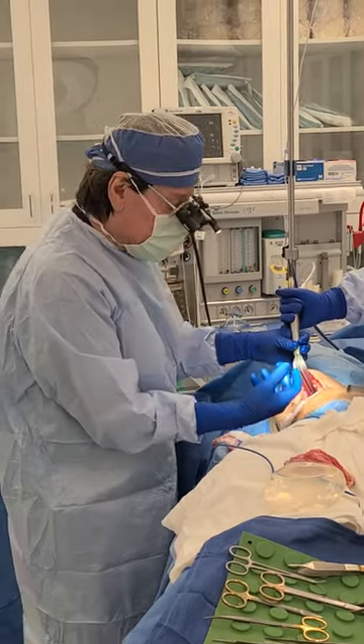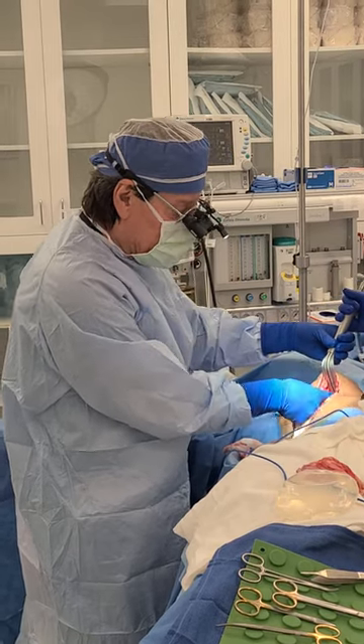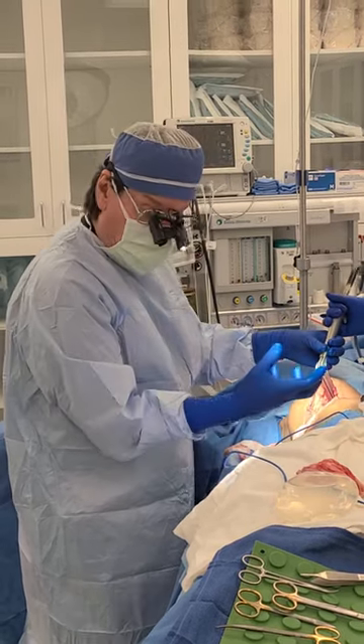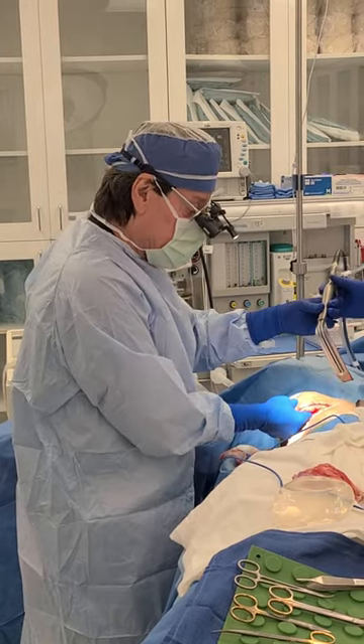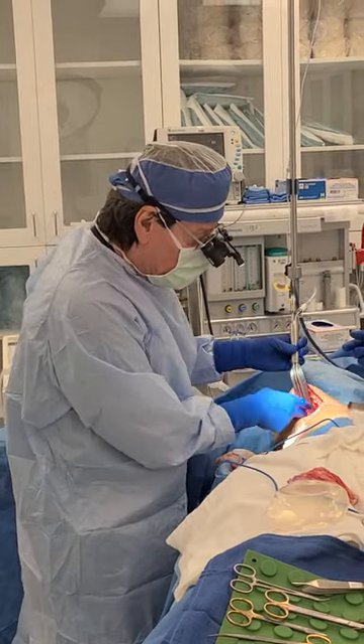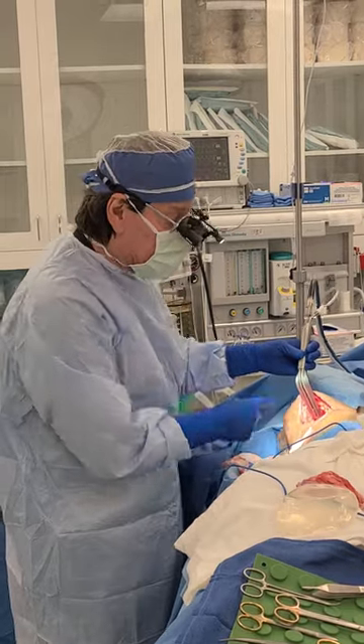So now that this has been completely taken out, the pocket is cleaned, all of the capsule has been removed, and now we're free to do the reconstruction with the Stratus and a new implant.